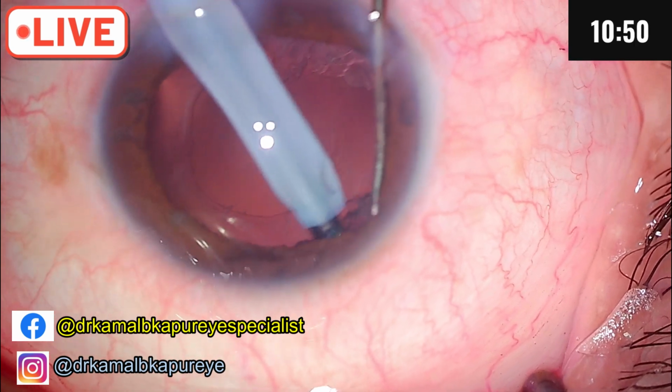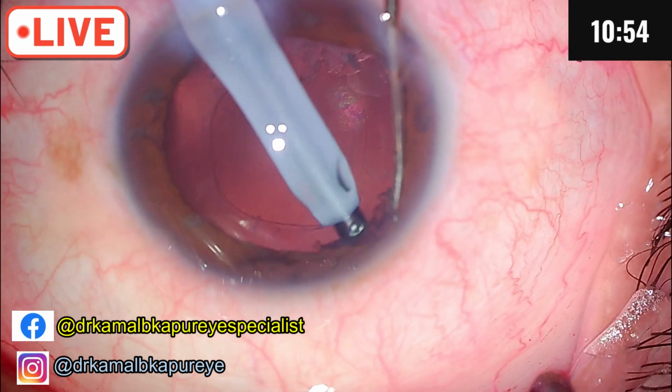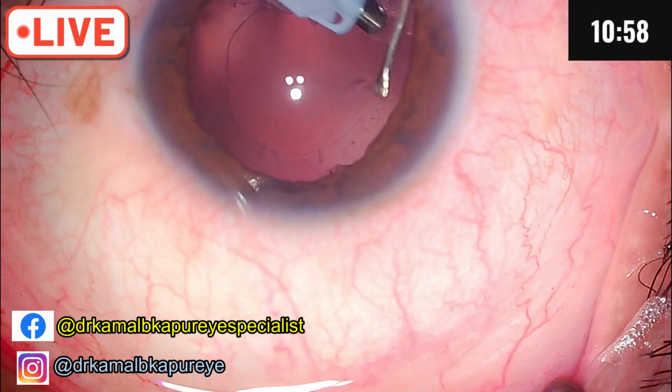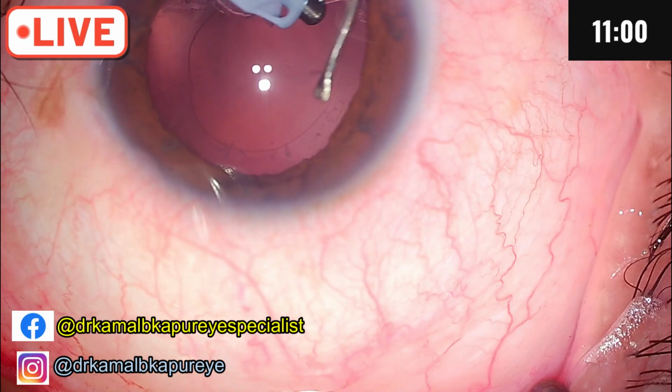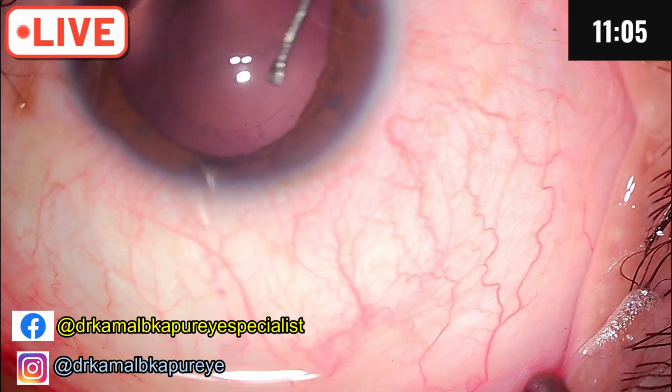The advantage of using a bimanual is you can use a second instrument actually to pull away the iris and get your visibility, which sometimes with the coaxial advantage of coaxial, which sometimes in a bimanual you cannot do.